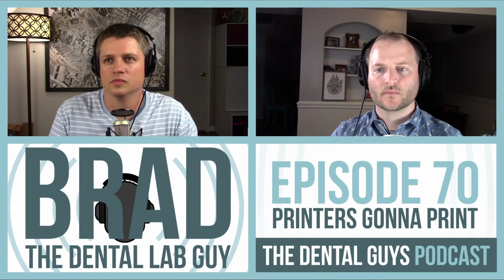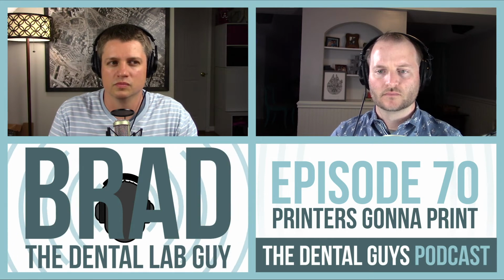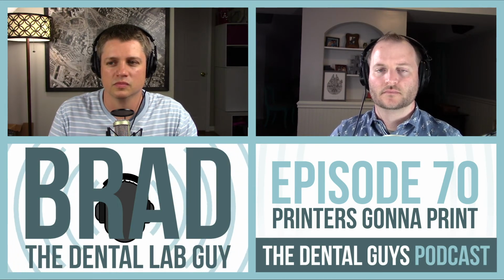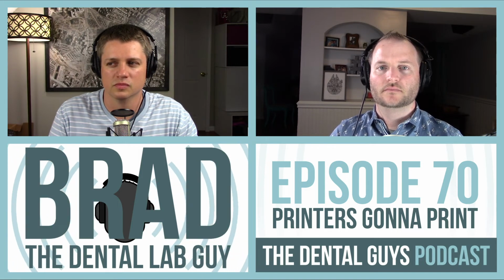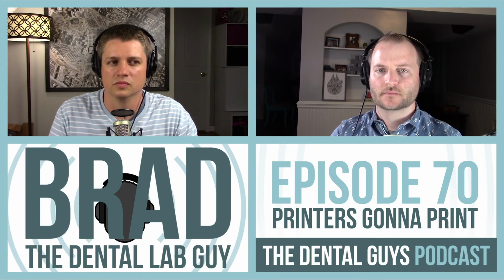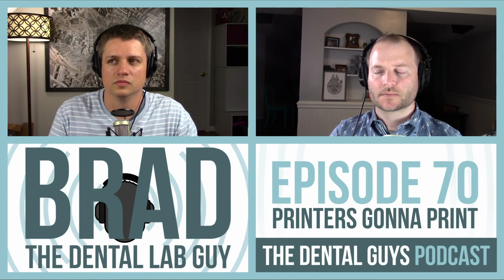And what does get me excited is the dentures. I think additive manufacturing in the denture world fits extremely, extremely well, because you don't have to have that super precision like you do with crowns. So I think once denture base hits and we have a multitude of different resins and resin colors, we're going to be printing denture base. I think we're going to be either milling or printing the teeth that go in them. That's what I get really excited about.